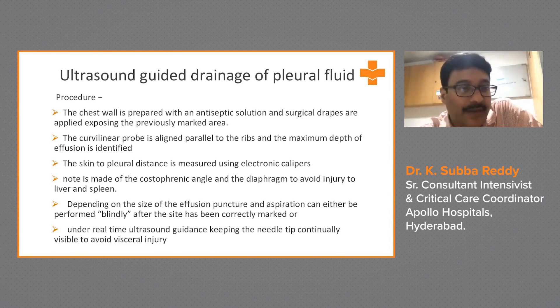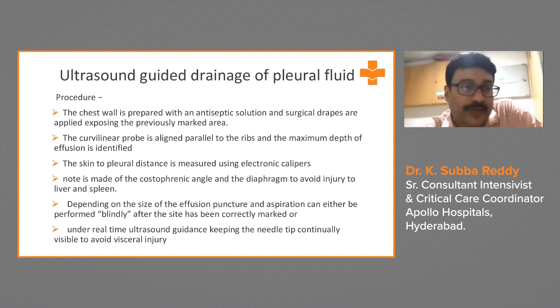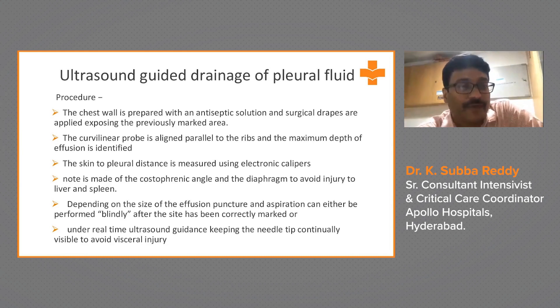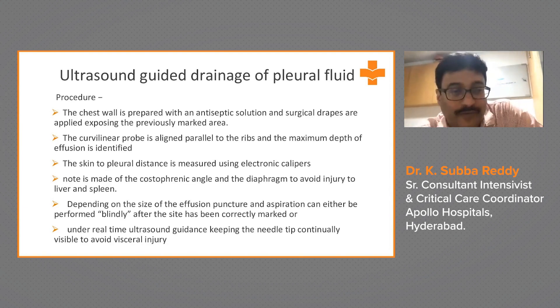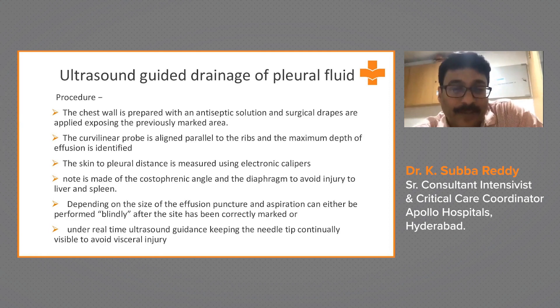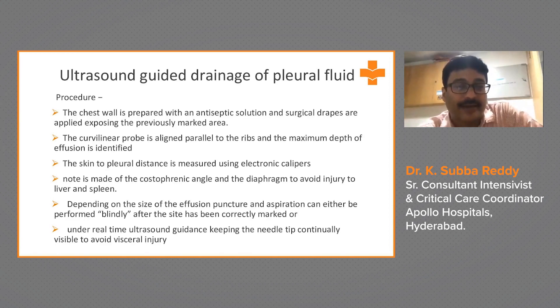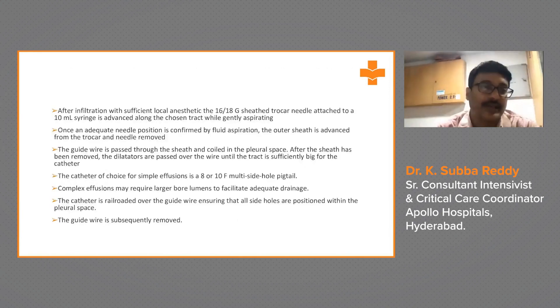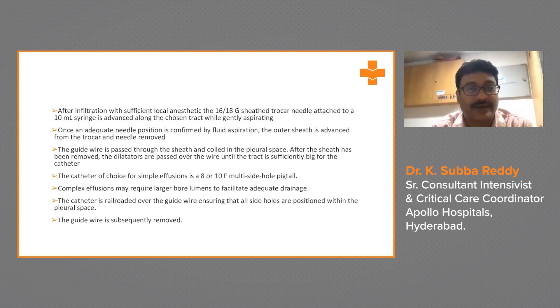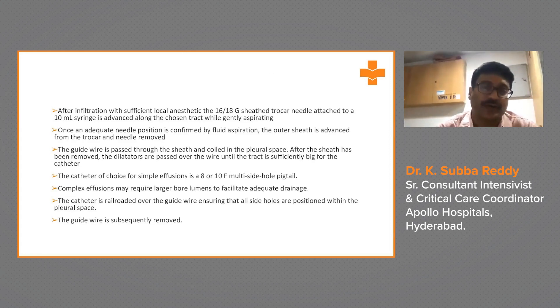The chest wall is prepared with antiseptic lotion and surgical drapes applied. The curvilinear probe is aligned parallel to the ribs and the maximum depth of the effusion is identified. Skin-to-pleural distance is measured using electronic calipers. Note the costophrenic angle and diaphragm to avoid injury to the liver and spleen. Depending on the size of effusion, puncture can be performed after marking the site or under real-time ultrasound guidance, keeping the needle tip continuously monitored.